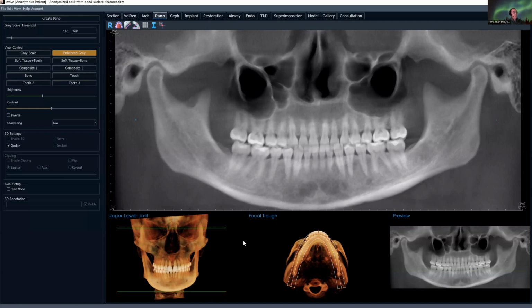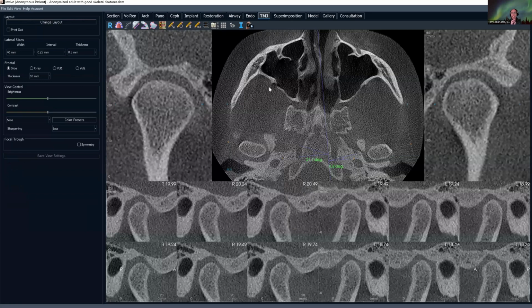Sometimes the image is as good or maybe a little bit better than panoramics, but commonly they're not. And that depends on if the patient's really class 2 or if their mouth is open, et cetera. It may alter the width of the focal trough and you get a lot more superimposition of other structures. Again, these are features that I've already set up this morning. I'm using the in vivo viewing software that has these other tools that allow you to create these sections. Those aren't critical for the actual Doctor Adair method, which we're going to get into, but this is just how I approach any image.